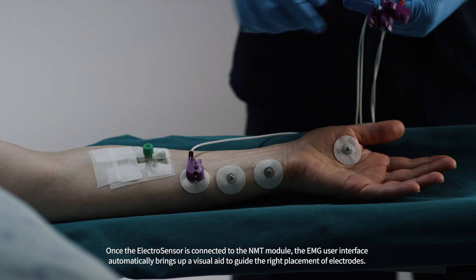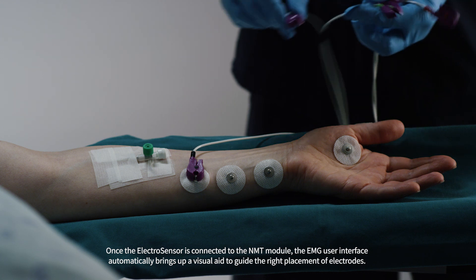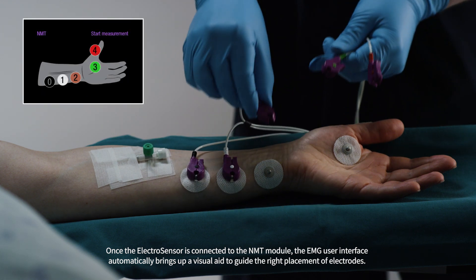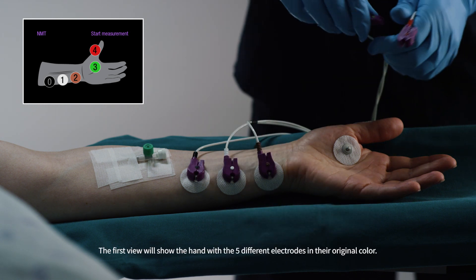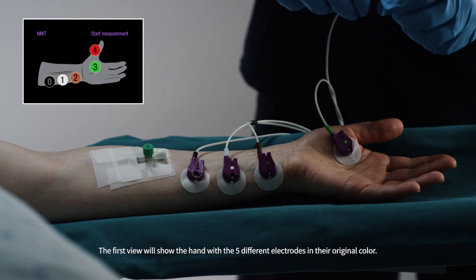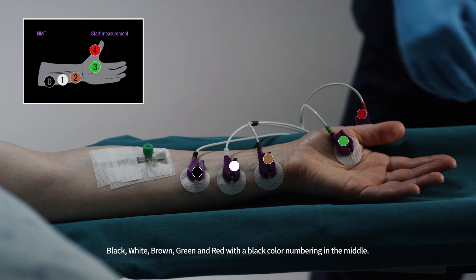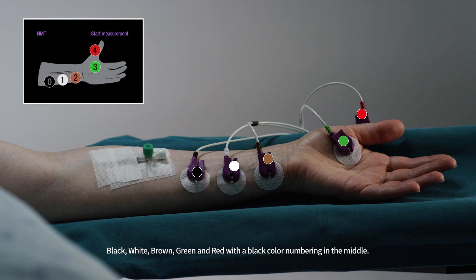Once the electrosensor is connected to the NMT module, the EMG user interface automatically brings up a visual aid to guide the right placement of electrodes. The first view will show a hand with five different electrodes in their original colors: black, white, brown, green, and red, with black numbering in the middle.